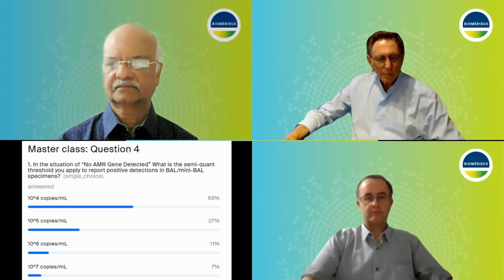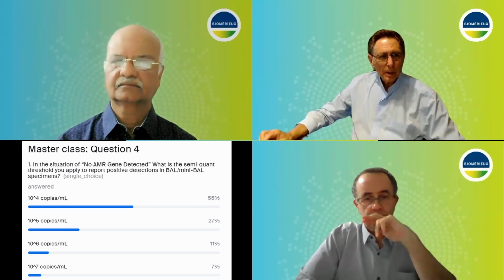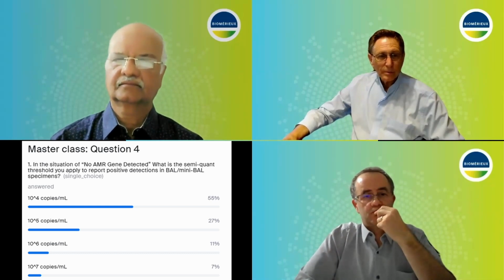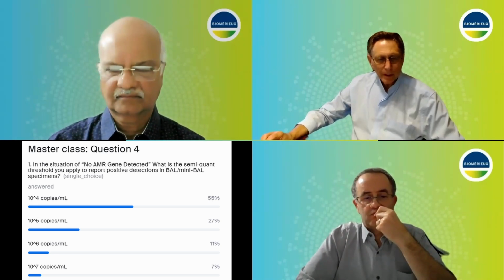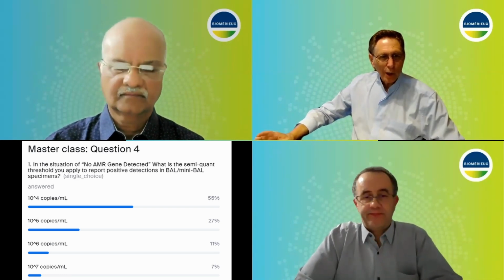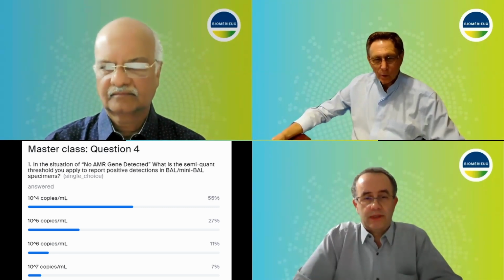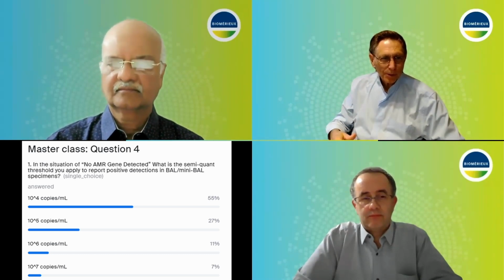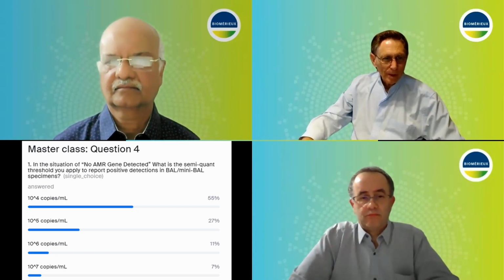At the 10 to the 4th, even for BALs, I still think is a relatively low number of copies. Certainly, if I get 10 to the 6th, 10 to the 7th, and it's by far the predominant organism and all the clinical signs and symptoms that I reviewed were present, I'm more likely to say that's the pathogen. And again, there are nuances here, and there are some gray areas, which I think Dr. Soman's case has certainly demonstrated, where again you still have to go back and use your best clinical judgment as to how to interpret these tests.